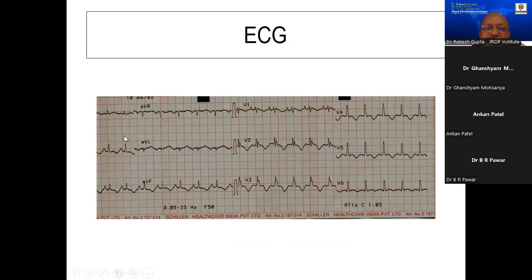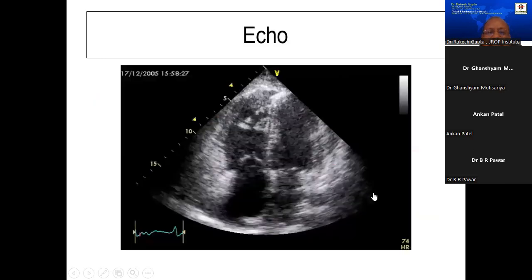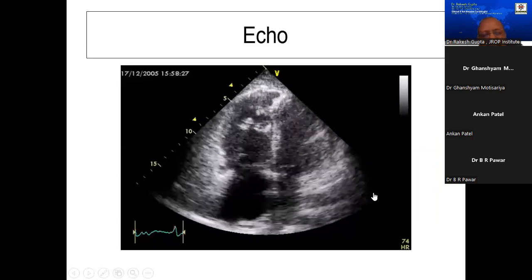You must have often seen this kind of an ECG. And if you look carefully at this ECG, there is a very unique kind of pattern. I'll come to this in a couple of minutes. And this patient, when we were examining this patient, suddenly went into this aberrant rhythm. This aberrant rhythm is like an LBB kind of pattern. Look at this widened QRS complex on the left-hand side. And here's a picture of this patient's echo once we revived this patient.